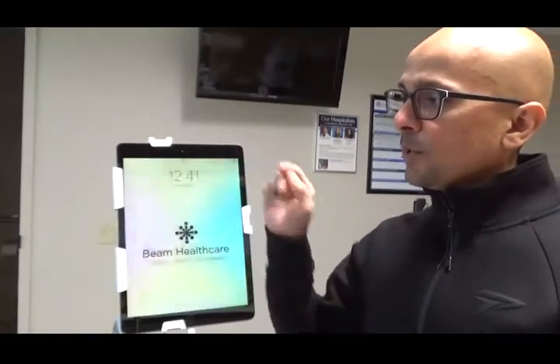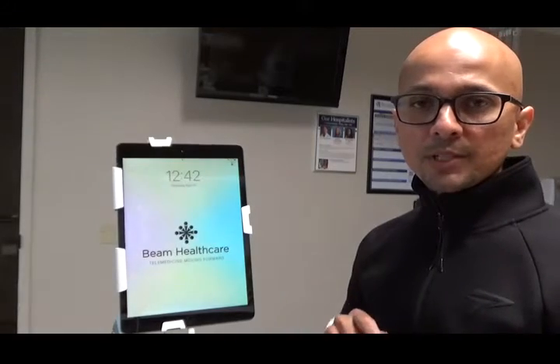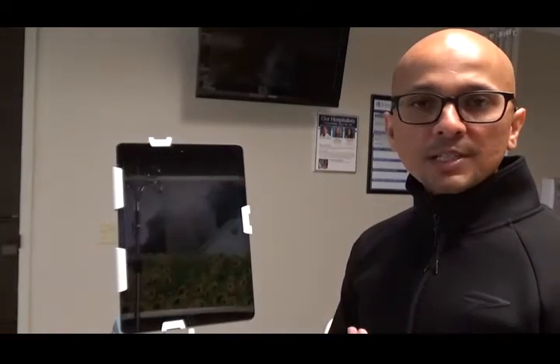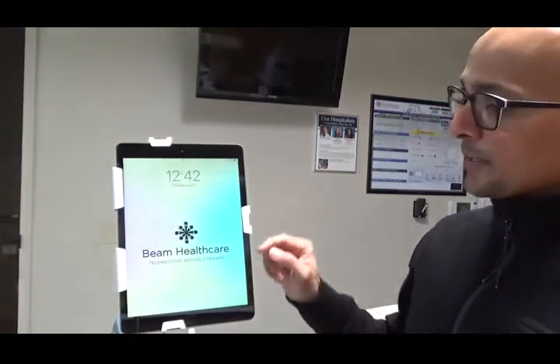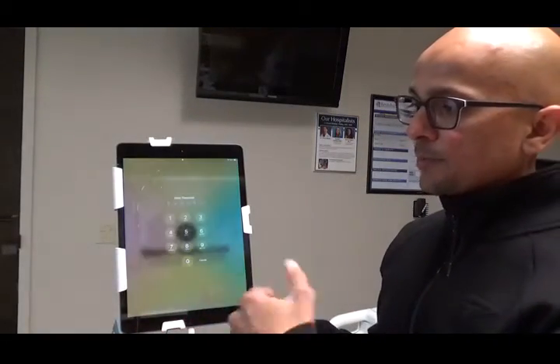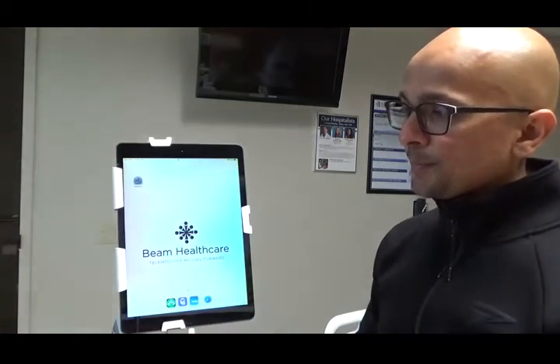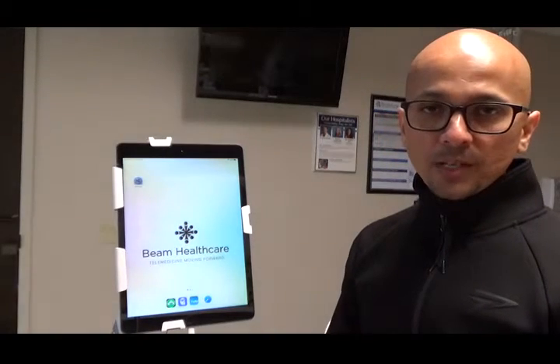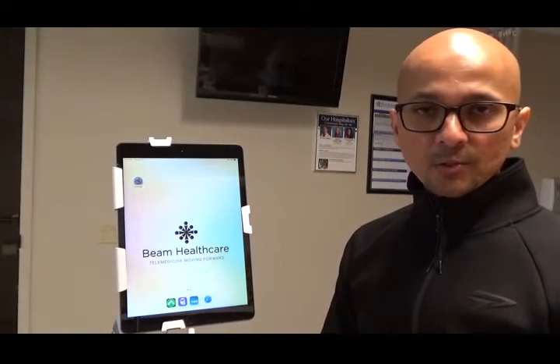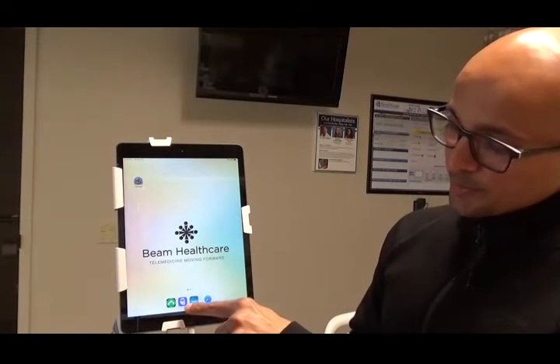Hey guys, wanted to show you how you could use the iPad card primarily for the telemedicine specialty side for inpatient and also outpatient. So for this iPad card, everyone's going to have a code that they use to first of all unlock the iPad, and then afterwards, the main thing that you'll be utilizing to conduct these telespecialty consults is really one app, which is right here that looks like a bird.